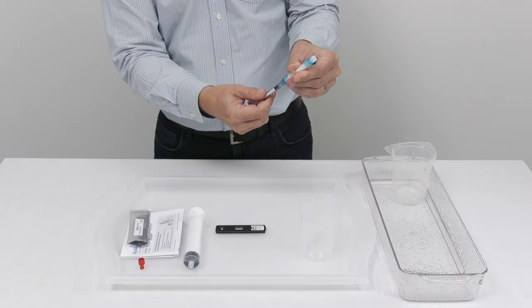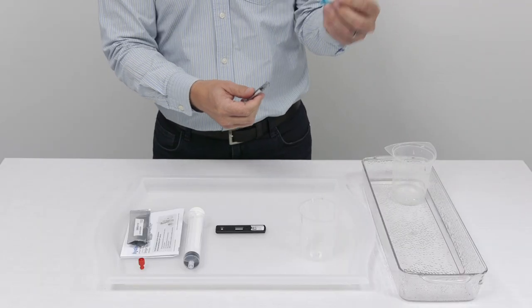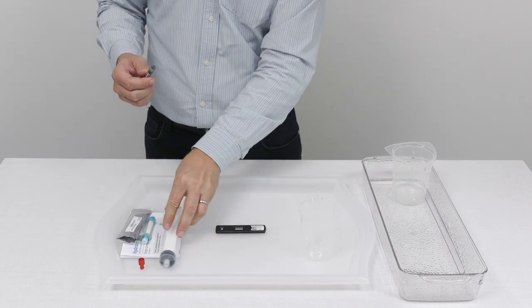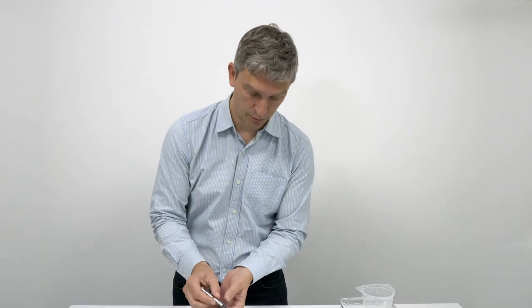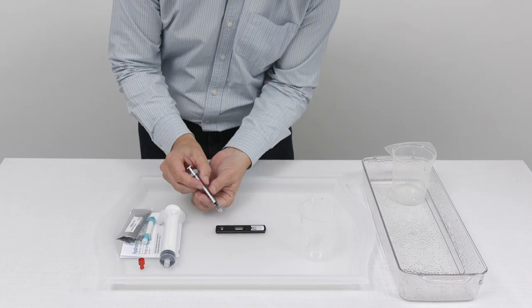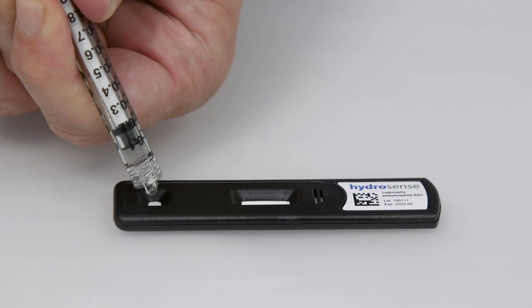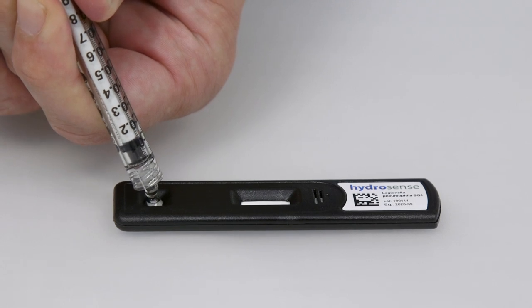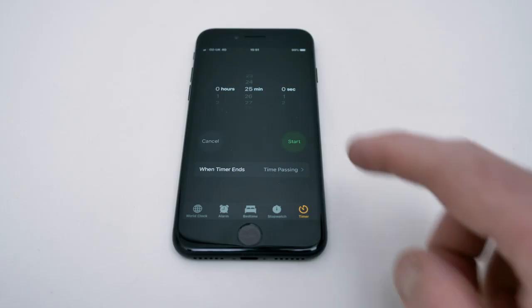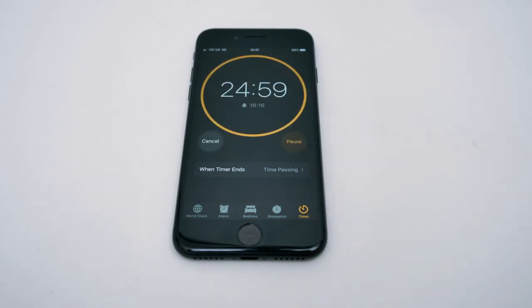So now we can detach the syringe in a twisting motion from the filter, place the filter to one side, and then we can add the 0.1 mils of sample to the sample port on the cassette by depressing the plunger. And at this point we would start a timer for 25 minutes and then read the test after 25 minutes and no longer than 30 minutes.